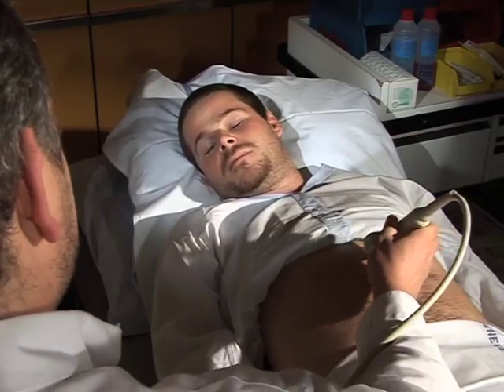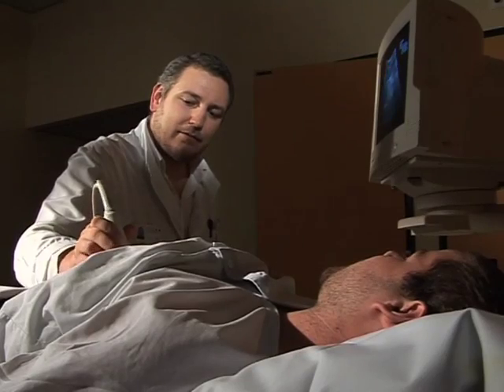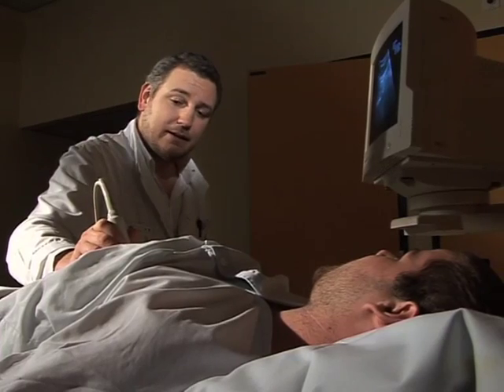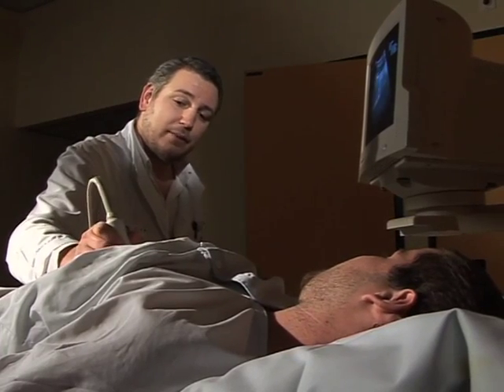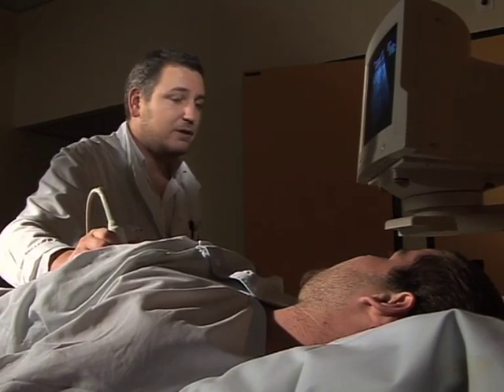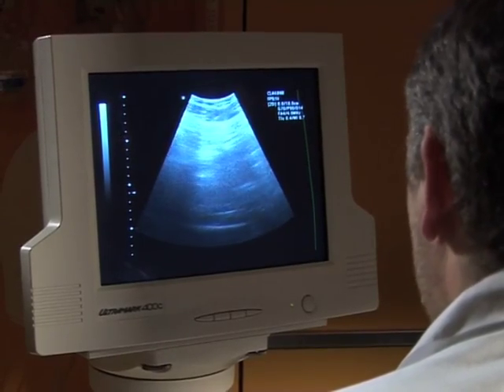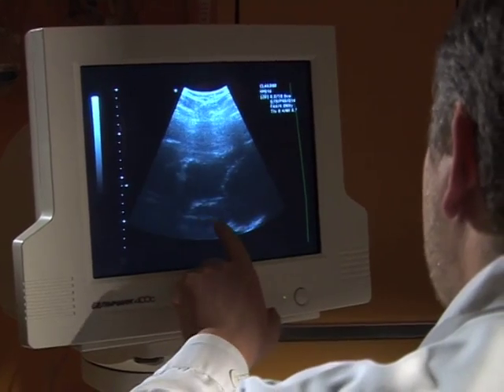I'm going to start with the probe and the gel. There, you see, it's a little cold but not unpleasant. And it's not painful. Let me know if I press too hard. And there we see your heart beating above your liver.